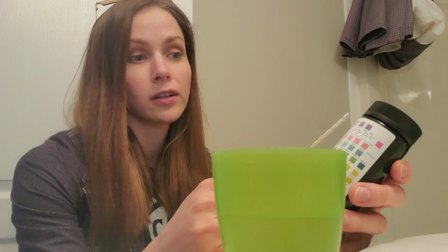Your body's trying to fight something in your bladder, like bacteria or whatever, and also just what my urine pH is, especially if taking the Uva Ursi that I showed you guys and the Golden Seal. They work better if your urine pH is above 7, so in an alkaline urine environment and not in an acidic one. So if you're taking that and your urine is not basic or alkaline, which means above 7 pH, then you can drink some baking soda in water a few times a day, and it usually says that on the Uva Ursi container. So the leukocytes look good, like there's nothing in there.